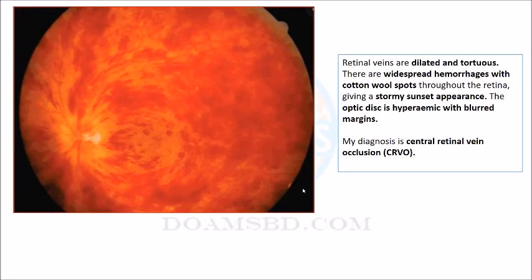Can you remember the word in the hypertensive retina? The bleeding nature is flame-shaped hemorrhage. And the disc may have papilledema. There may be different grades of hypertension, silver wiring, copper wiring. I will show you today.